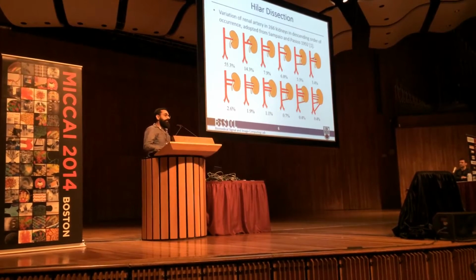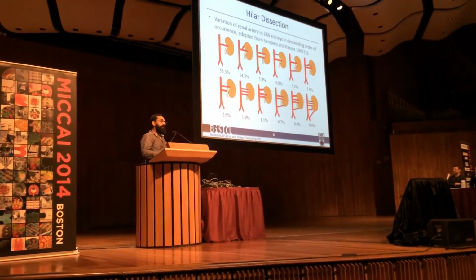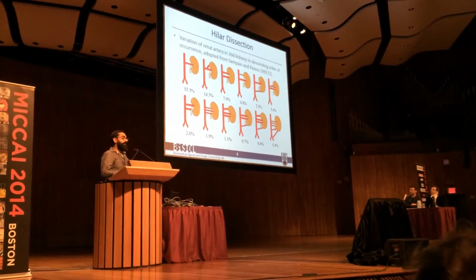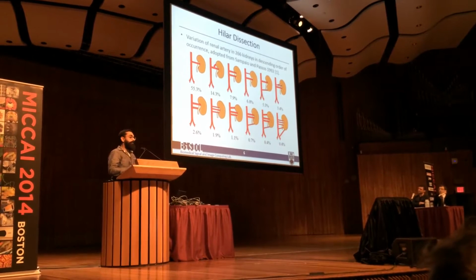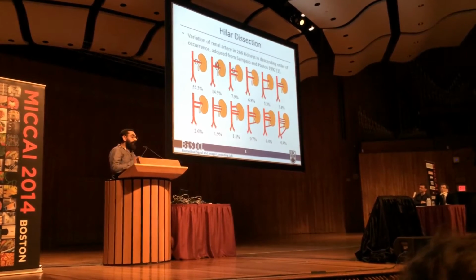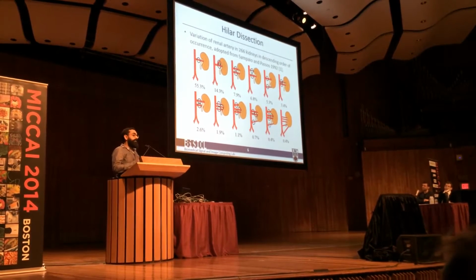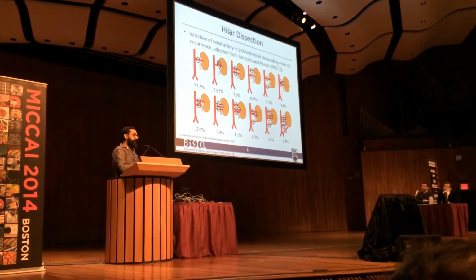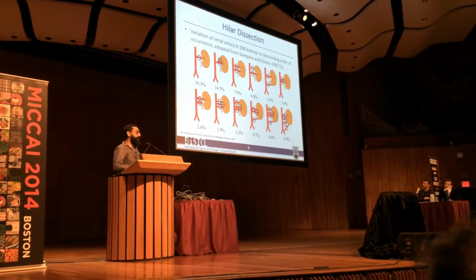Further complications result from variation in patient's vascular anatomy. This visualization captures the variation in renal arterial structures among 266 different kidneys, and the presence of accessory renal arteries. This implies that the surgeon needs to identify and locate all of these accessory arteries such that the bleeding doesn't happen during the intervention.